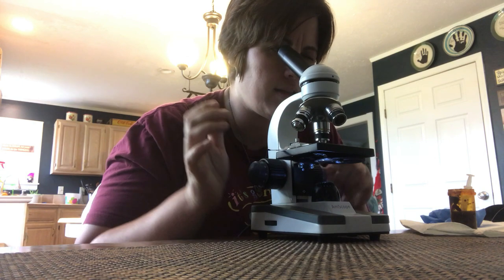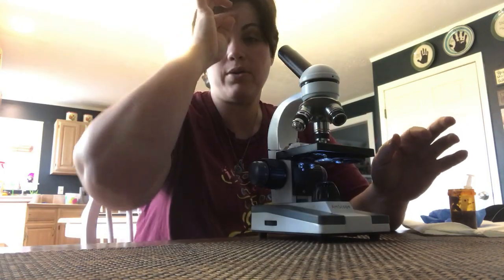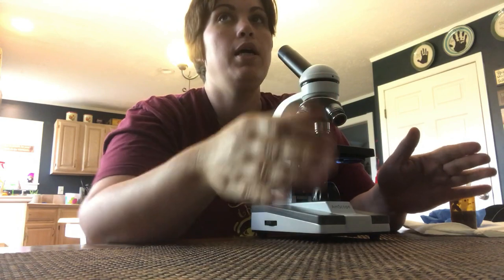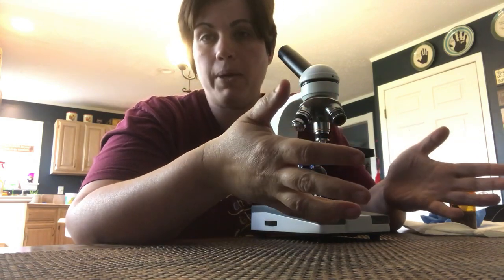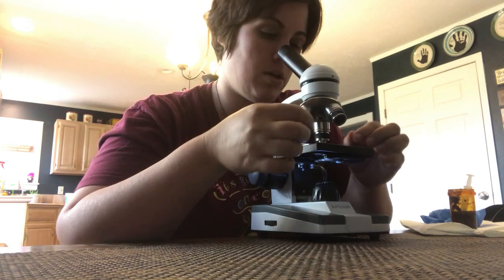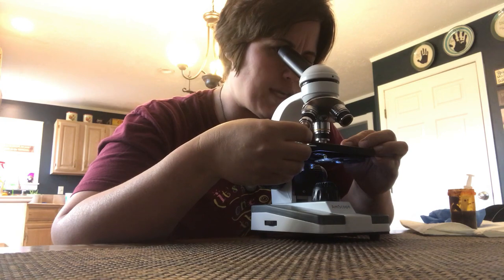Now I do see one little coccidia in this one, and that was the main thing that I was really worried about. He's only about three months old, so having parasites is a little more unusual for a younger goat. Typically when they're really young, they don't have as much issue — doesn't mean they can't. So what I found is actually a mild to maybe moderate case of coccidia.